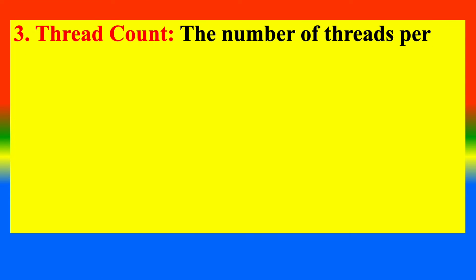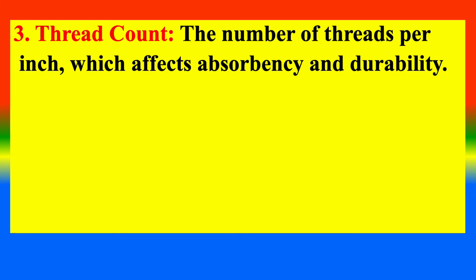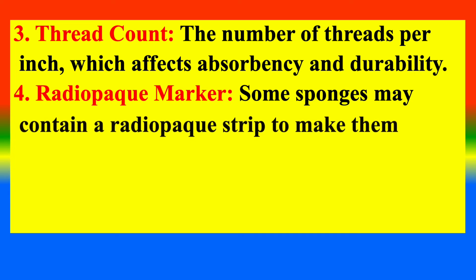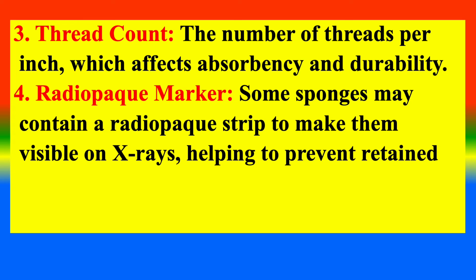3. Thread count, the number of threads per inch, which affects absorbency and durability. 4. Radio-opaque marker, some sponges may contain a radio-opaque strip to make them visible on X-rays, helping to prevent retaining sponges post-surgery.